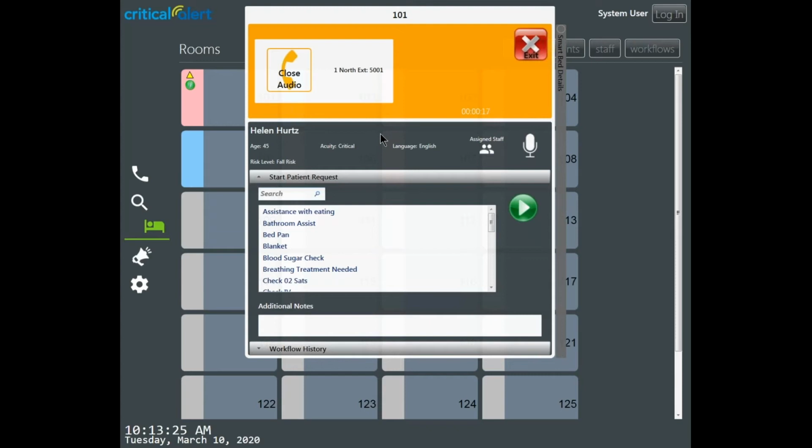Typically with nurse call systems today, they would just answer the call saying, "Yes, can I help you?" And the patient always wants their nurse because it's a voice in the room. They don't know who they're talking to, so they want somebody they feel comfortable with, which is usually a nurse. So we change that by saying, "Miss Hertz, this is Shane. How can I help you?"